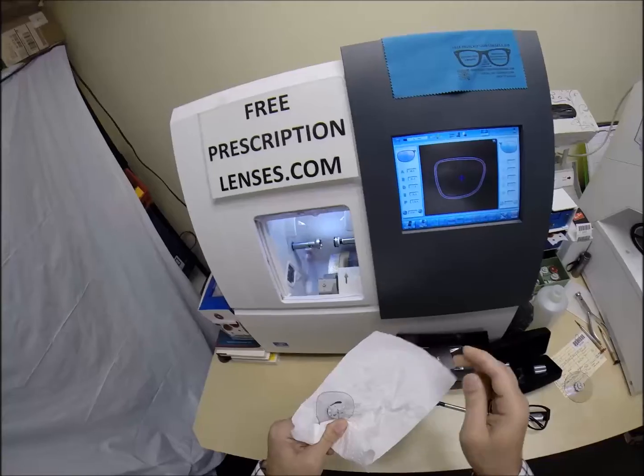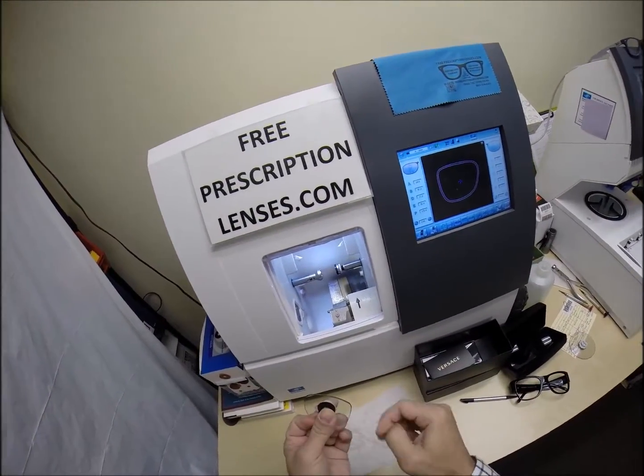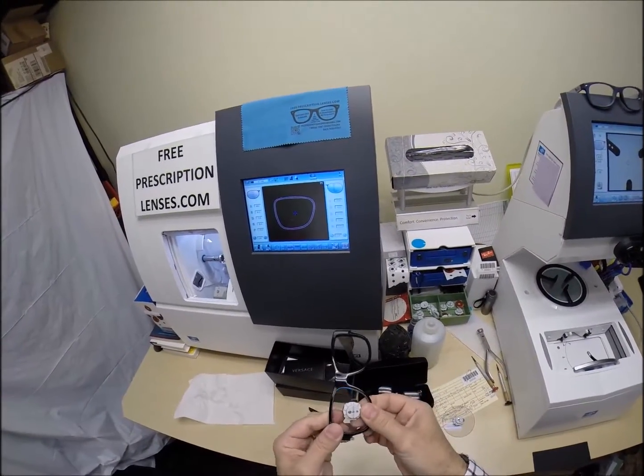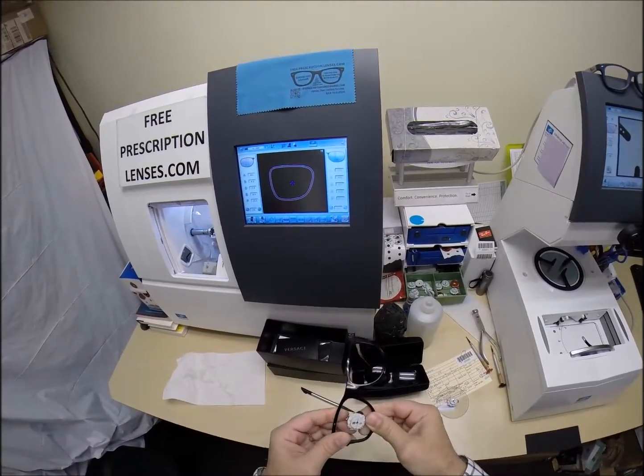Okay, so let's go ahead and dry everything off. Let's see if it fits into the frame. Make sure there's no optical sawdust anywhere on the edge of the lens. Let's see if it fits first time around. If not, I'll take it down a little more. I'm going to tuck it in at the outside corner. Push down at the nose, it snaps right in.